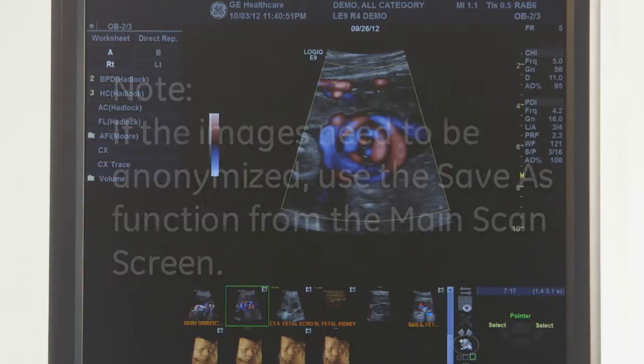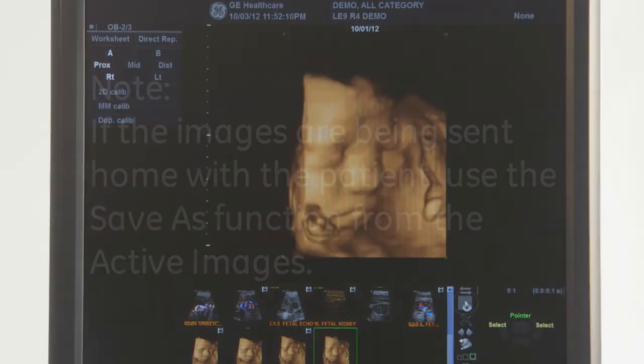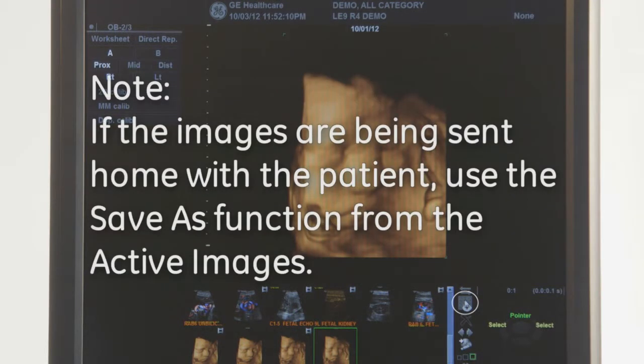Saving individual images as JPEG or AVI format can be done for presentation or to send home with the patient. If the images need to be anonymized, use the Save As function from the main scan screen. If sending with the patient, use Save As from the active images.